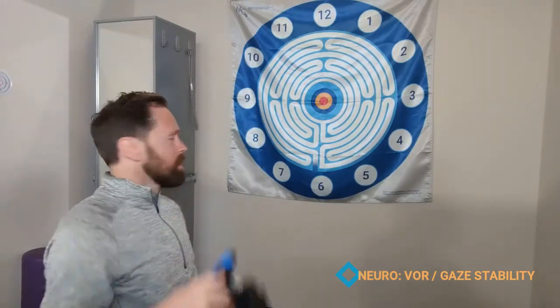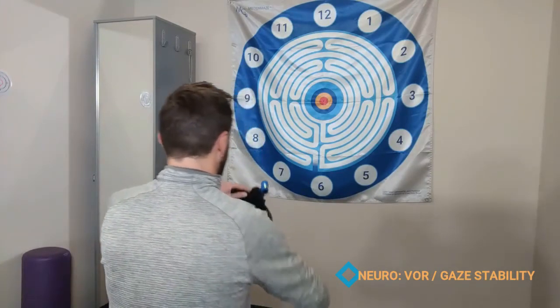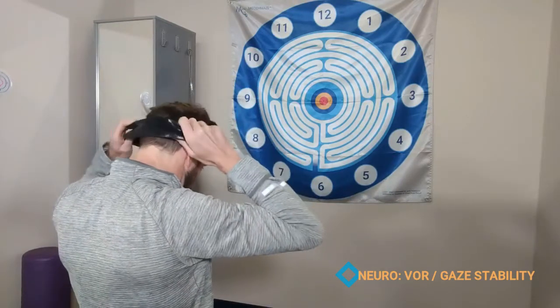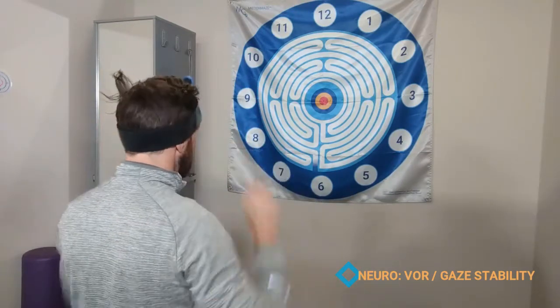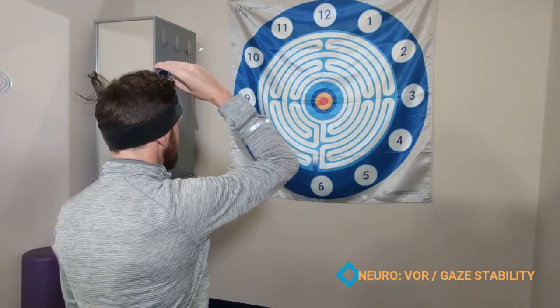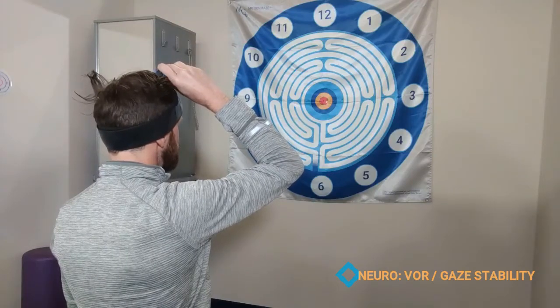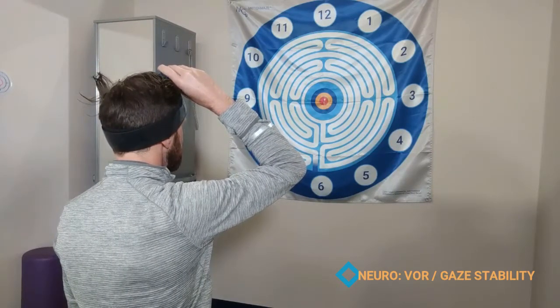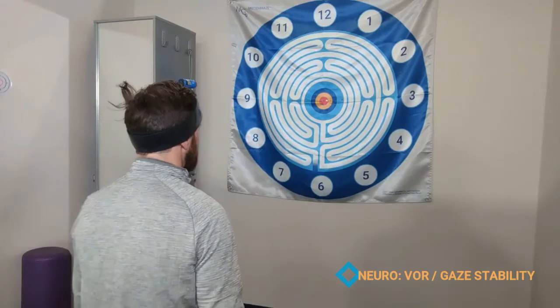We're going to use the head cradle and we're just going to start in an upright position. I'm going to mount this on my head, and to standardize the head and laser together, we're going to have them look at the center target and aim that laser right where they're looking at the center target. This now represents straight ahead on my visual field at the target.